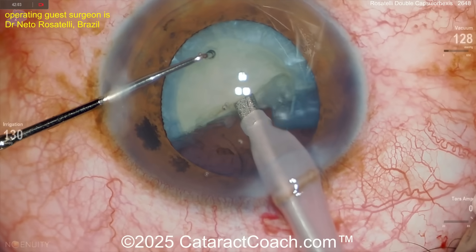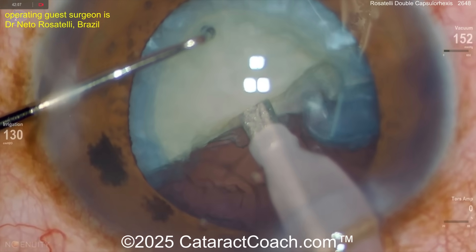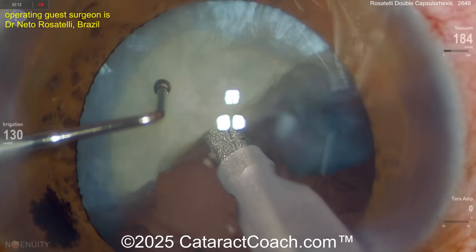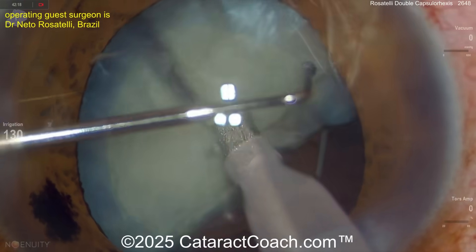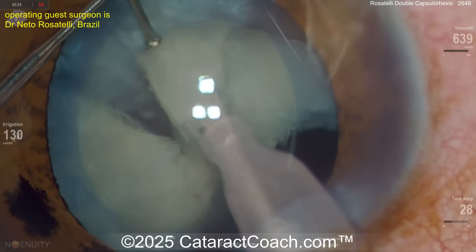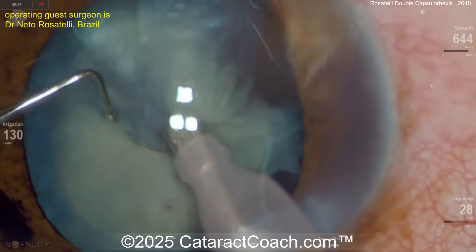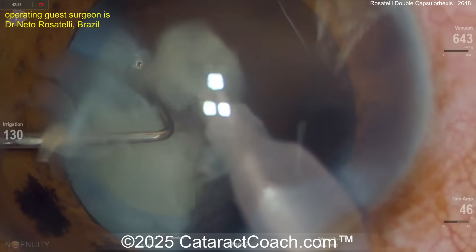You want to be a great cataract surgeon — you've got to learn it all. Let's zoom in and take a look: buzzing in with the phaco probe right into the meat of the nucleus. There's that special pentagonal tip. The chopper goes around the equator — pow — easily cracked, easily chopped. Now you have quarters, now you've got eighths. Chopped so effortlessly — those can be removed very easily.